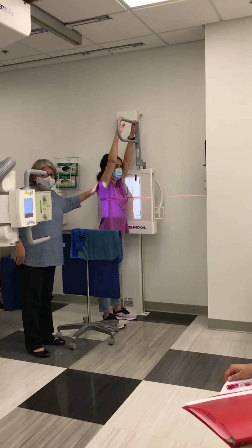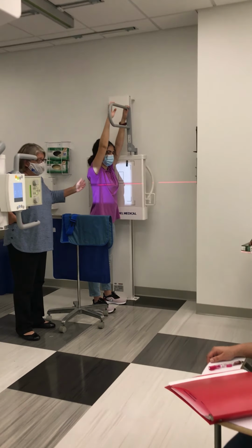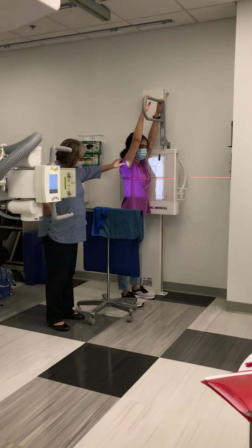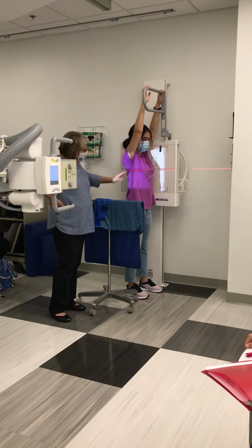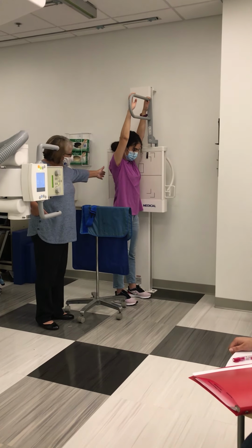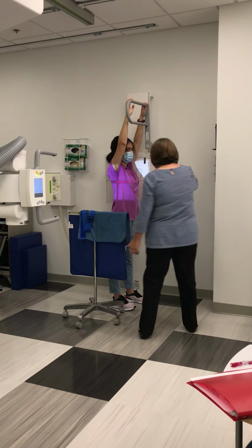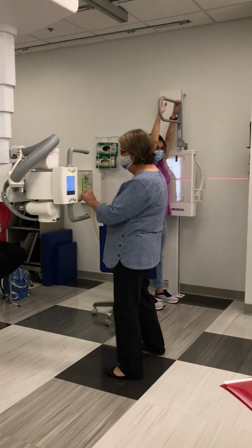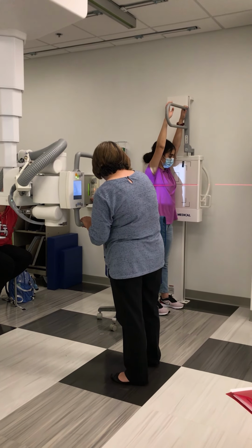I want to center the mid-coronal plane. So I want to center on the patient. Step forward, please. There you go. Now then, I'm centered anterior to posterior. I see a little light behind my patient, and I see a little light in front of my patient. Actually, with this patient, I could probably collimate in a smidgen.